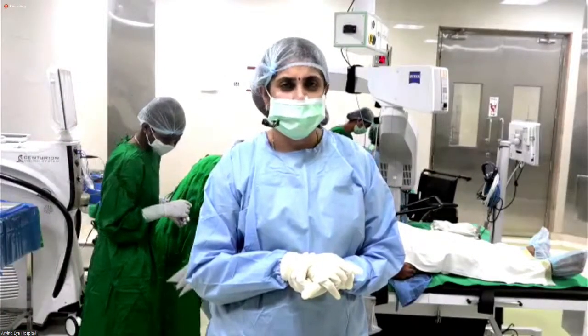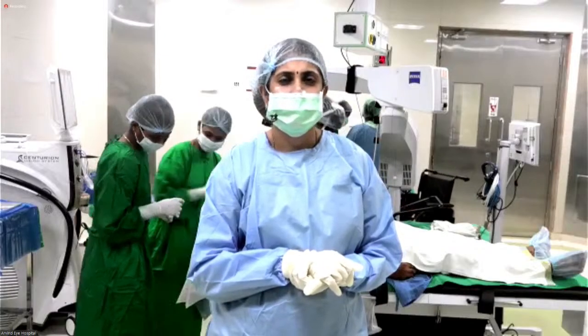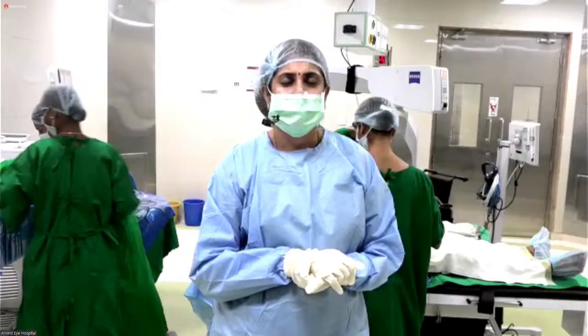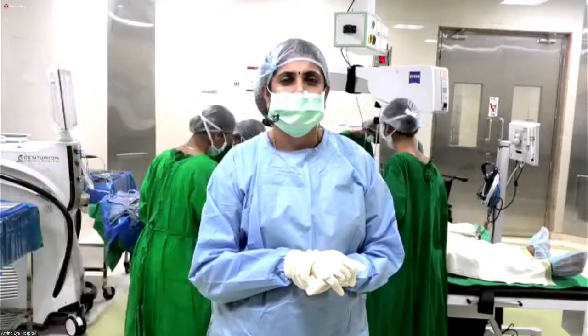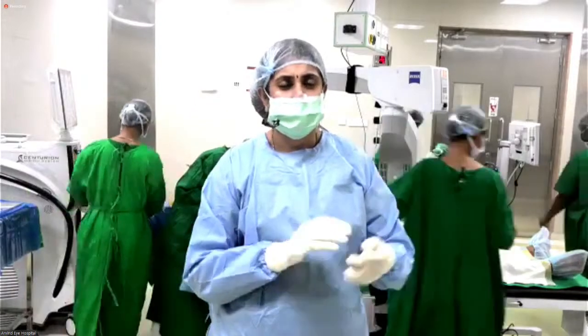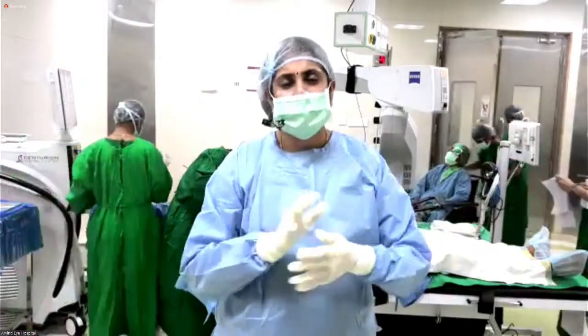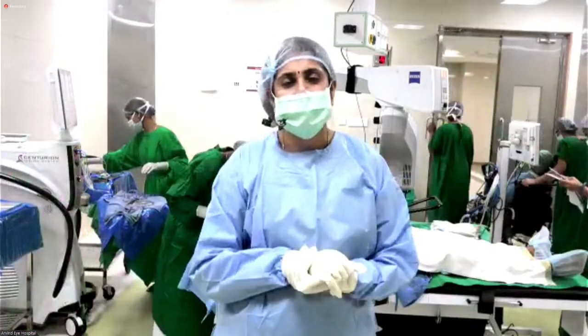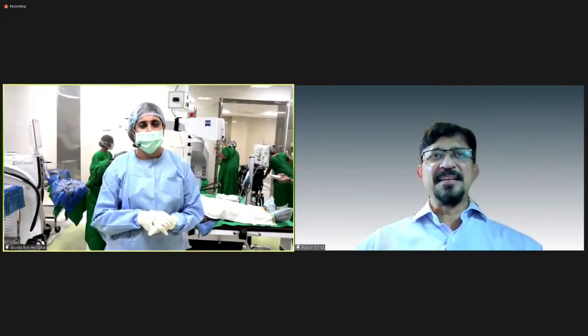Definitely. The way you injected was absolutely smooth. It went very nicely. The biggest advantage that you told, that with the second instrument, you can stabilize the globe and keep it absolutely well centered. Yeah, and also you can guide the optic into the bag, even if it tends to tilt slightly or come out, you can always guide it back. So both the haptics go into the bag as they unfold. That could also be an advantage.